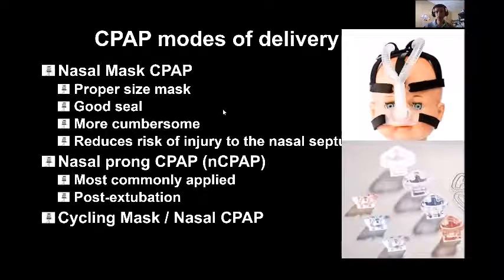How do we deliver CPAP to the patient? We can use a nasal mask. And we have different sizes of nasal mask. It depends on the size of the patient. We should seal it very well. We should fix it very well.